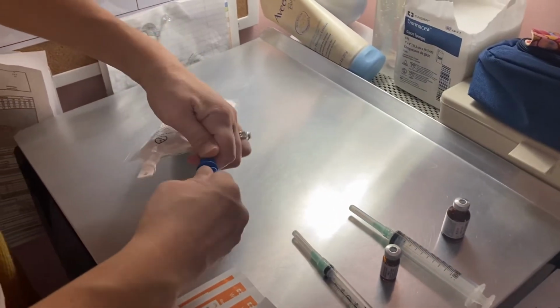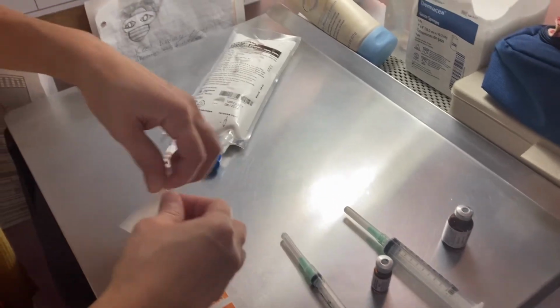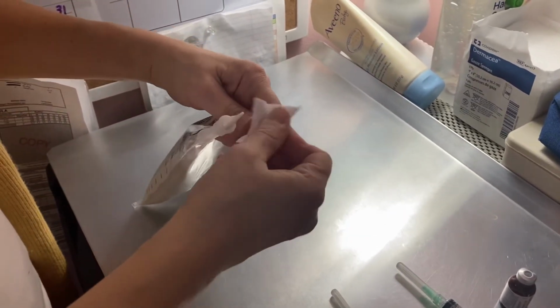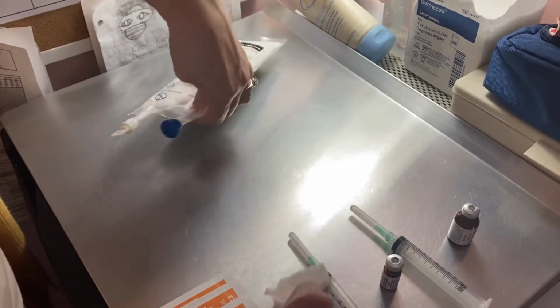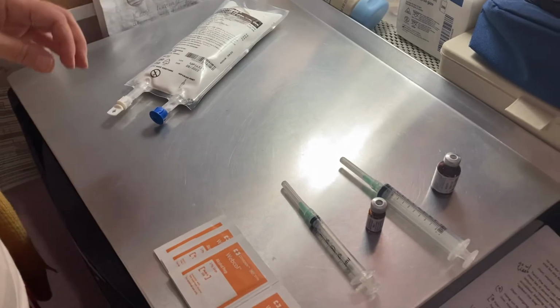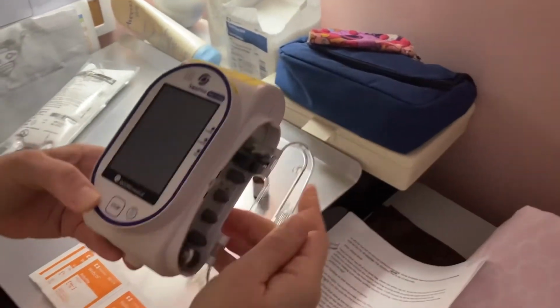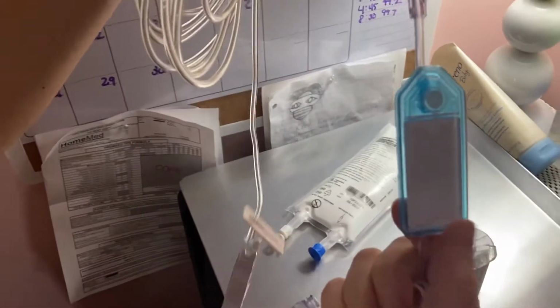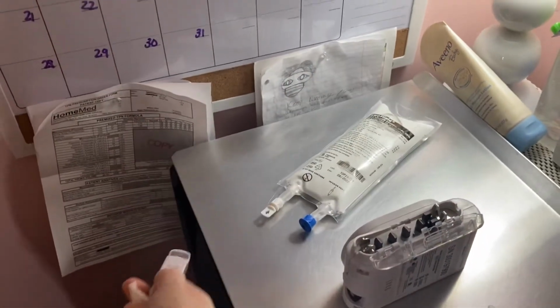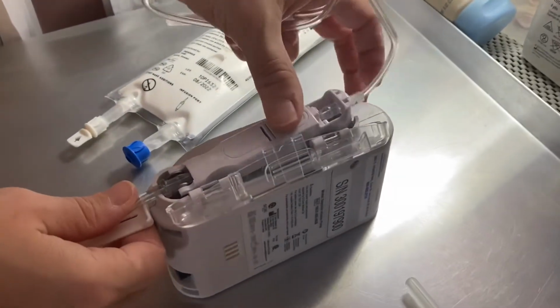Twist the blue cap off of the lipids bag. Leave the white cap on. Scrub the blue cap for 15 seconds. And then lay it down without the cap touching anything. Grab the lipids pump. It has the S on it for SMOF. Grab the tubing set with the blue filter. Pop the cassette in and close the door.